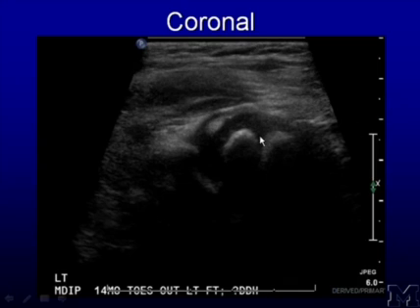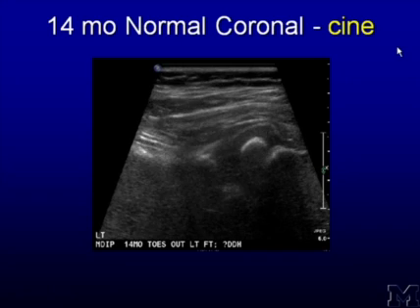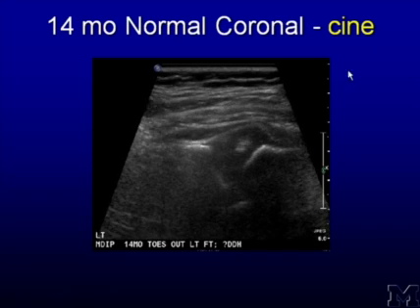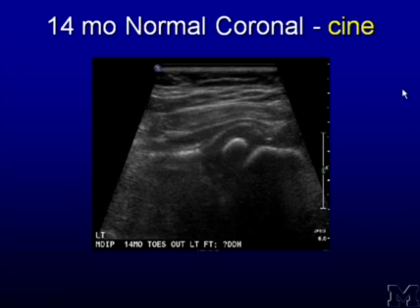And you can see the real challenge because a lot of ossification is already present. You don't see the acetabulum that well. Here's the femoral head. Here's the acetabular roof. When I did this study, I felt that the ball is in the socket. The head is within the acetabulum. The acetabulum looks fairly normal, but you could have told all this much more easily and quickly on a radiograph. This is a coronal and just showing how we're trying to find the right planes. But you get the sense that it is in the proper position, but it can really be a challenge in the older child.